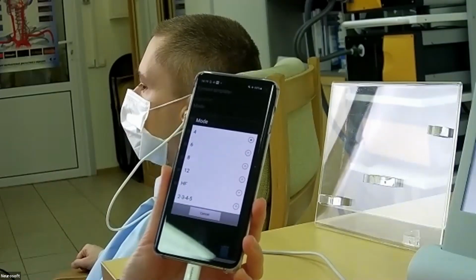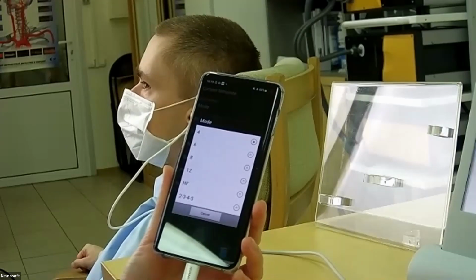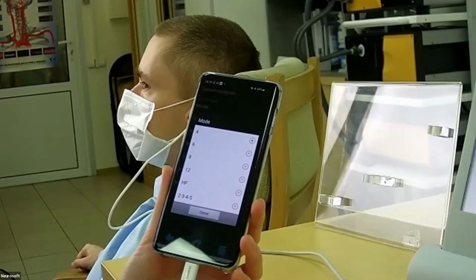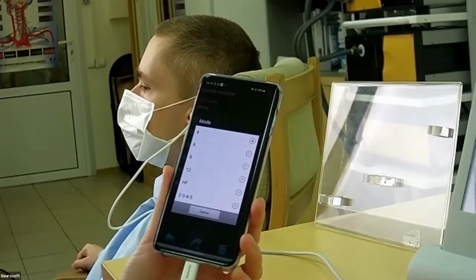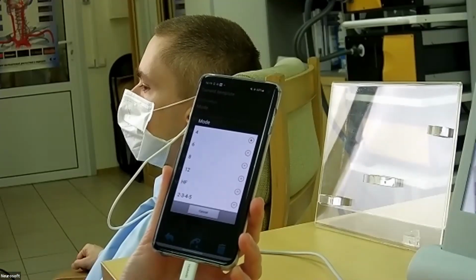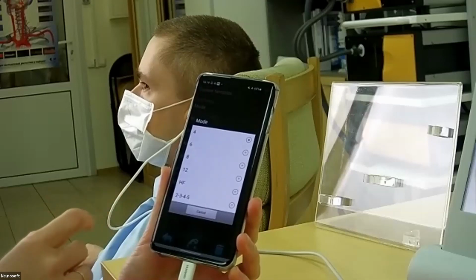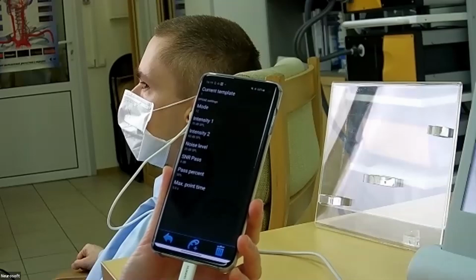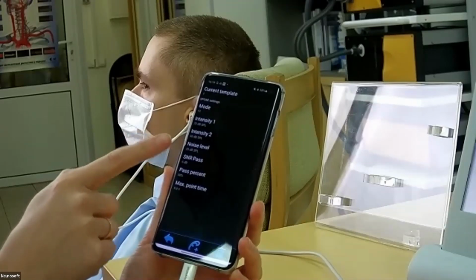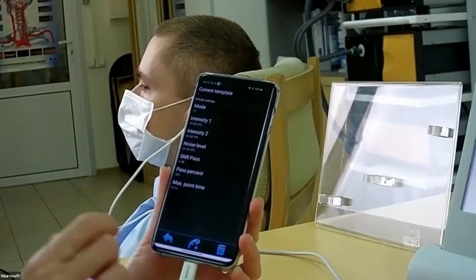Michael has said before that it's very useful to use the high frequency distortion product otoacoustic emission test with suspicious ototoxicity, or maybe noisy conditions, or hearing loss in some patients. So let's try, for example, to make 12 frequencies next time. And we see all the others we can change as well.